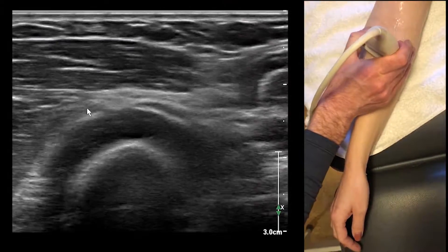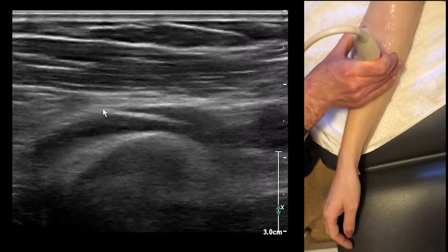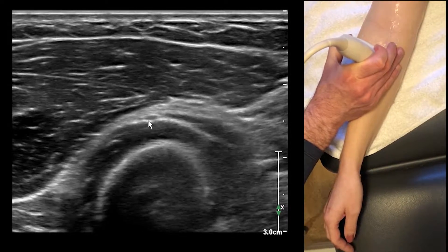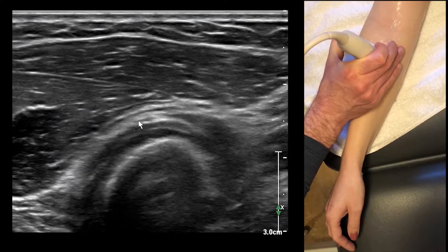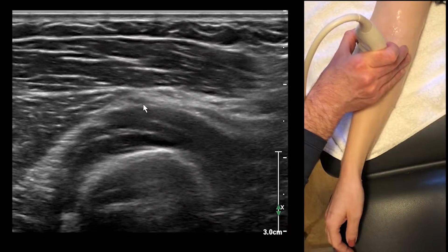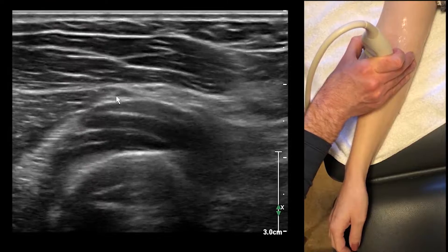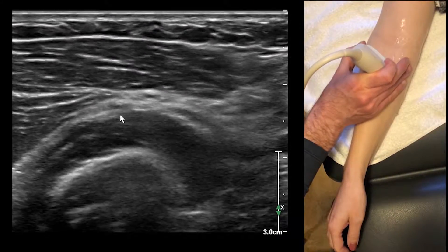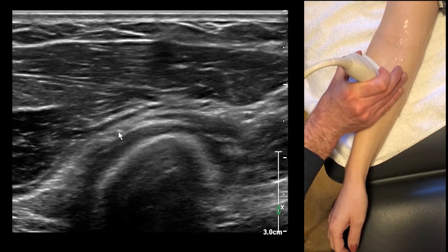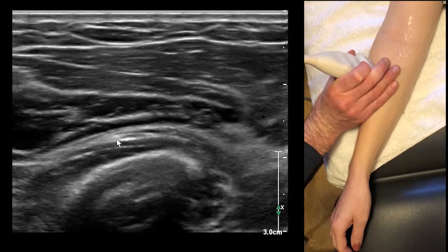So I'm going to go back into short axis now. Here you can see that little plane. Here is the posterior interosseous nerve — there are going to be two or three little fascicles that go with it. Here's the posterior interosseous nerve — follow it down. Here, a couple of little fascicles. It's going deep, it's coming around.